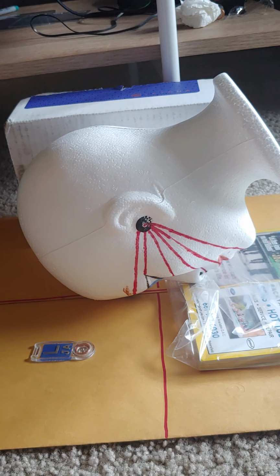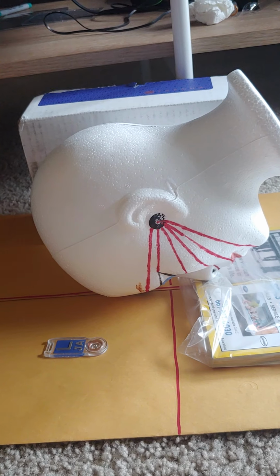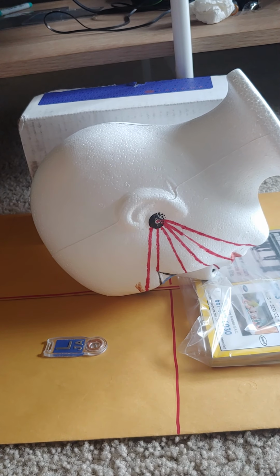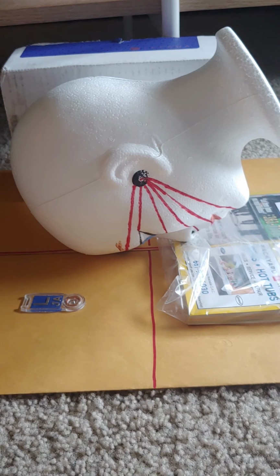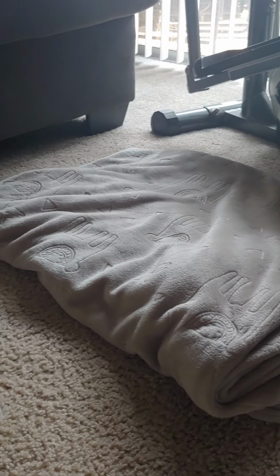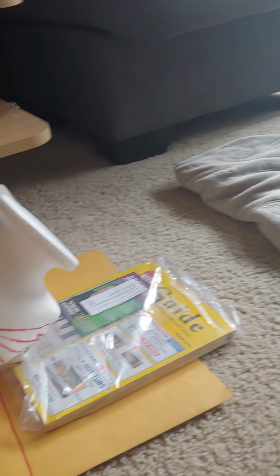In this projection, you want to see the petrous ridges in the lower 1/3 of the orbits. And you can see I have a left marker indicating that that was the patient's left side. And the blanket demonstrates that this patient would have been shielded for this exam.